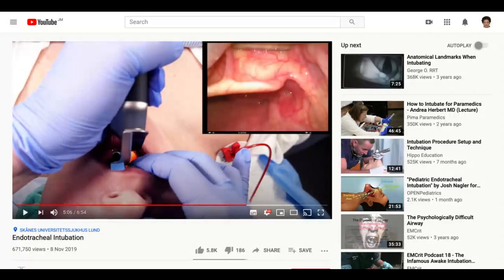Firstly, where is anterior? Top, the top. Top is anterior, all right? So the blade, you can just see the blade, that's the vallecula. The vallecula is between the tongue and the epiglottis, right? So therefore, if I ask you in your MCQ, how do you encounter it?